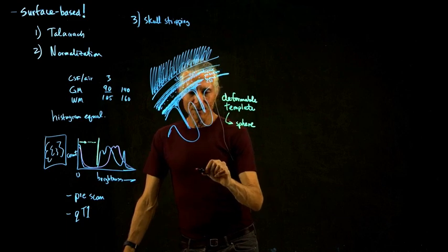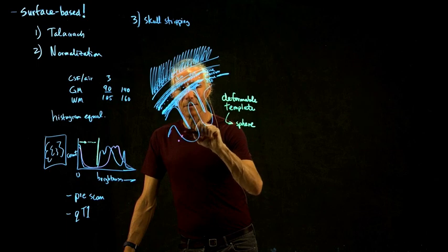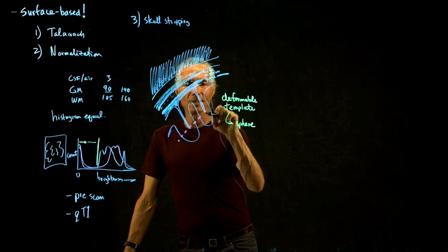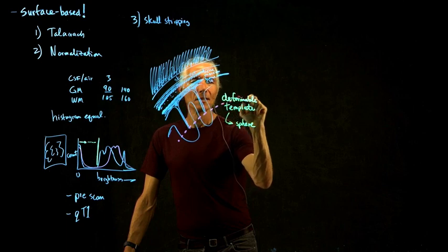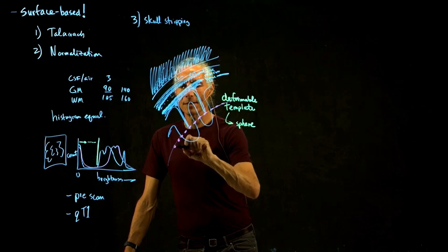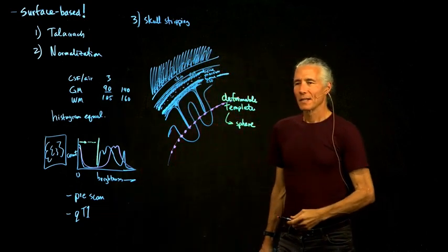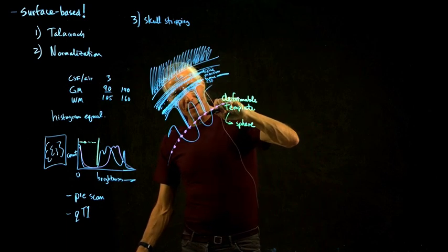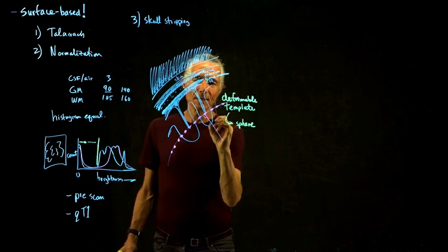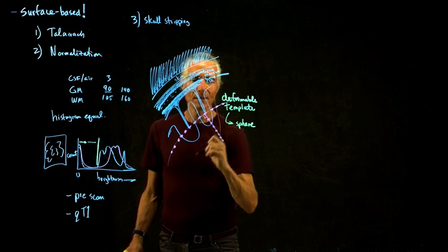The idea is you start off with a sphere that's inside the brain. So we place a sphere inside the brain like this. So here's our sphere. These are some individual points on the sphere. And now what we want is a little core sample. So here's a core sample perpendicular to the sphere. And here's a bunch of samples along the core sample. So we can sample the image.